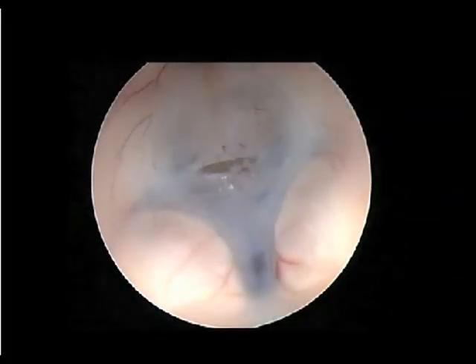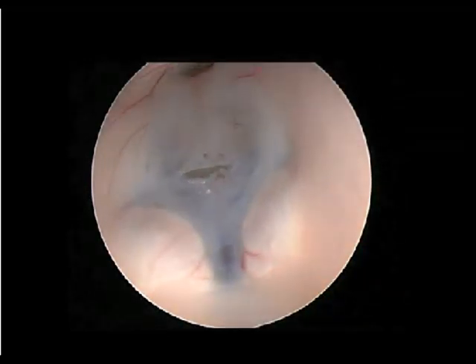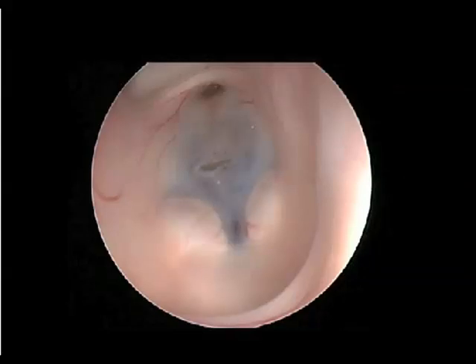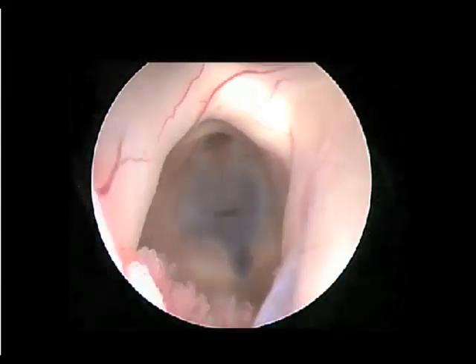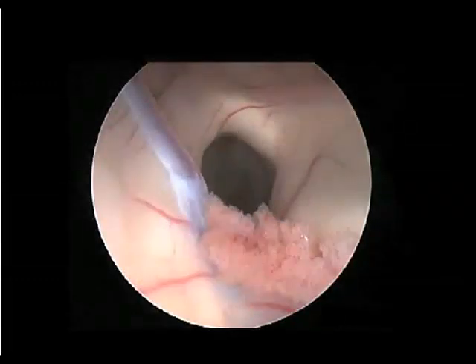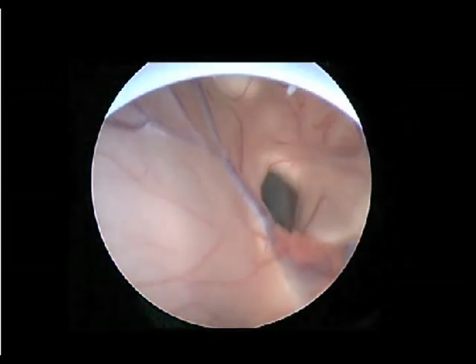The change in pulsations of the floor of the third ventricle indicates that CSF is now flowing freely from the third ventricle to the prepontine cistern and on to the cortical subarachnoid space. After the fenestration has been made, the ventricular system is inspected to ensure that there are no active sites of bleeding prior to completing the procedure.